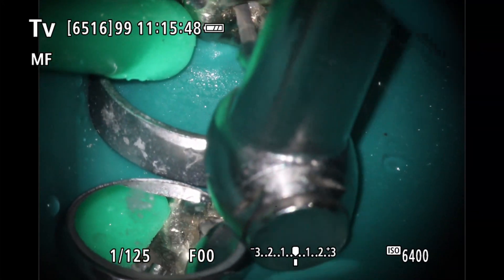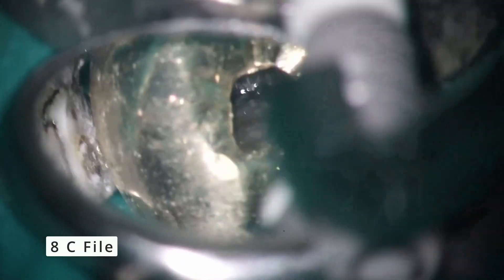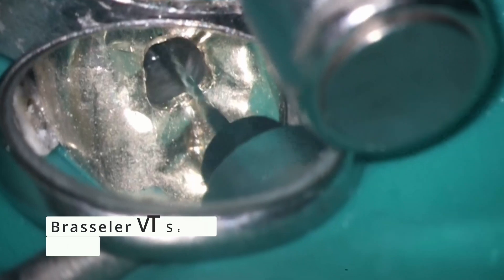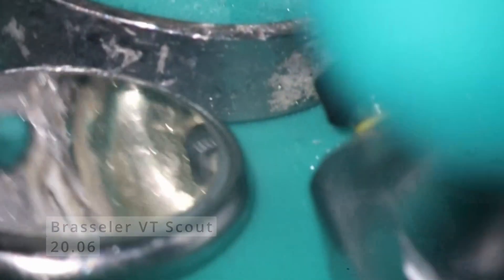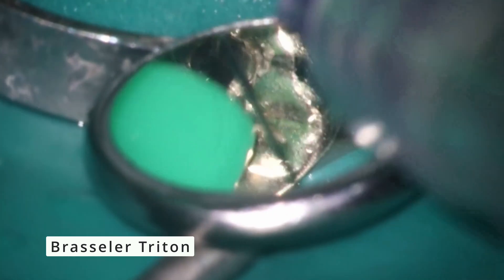Right after this is where the numbers go away. But in case you're wondering what my settings are for the video, there you go. So once we're inside there, go ahead and use the 8C file like normal to gain patency. Just get down to the bottom, get that glide path in there. Start off at the 2006. It felt like a single distal — it actually kind of is where they all coalesce into one. So I got the main one and then eventually went back and cleaned out the others, but it was just one solid canal.